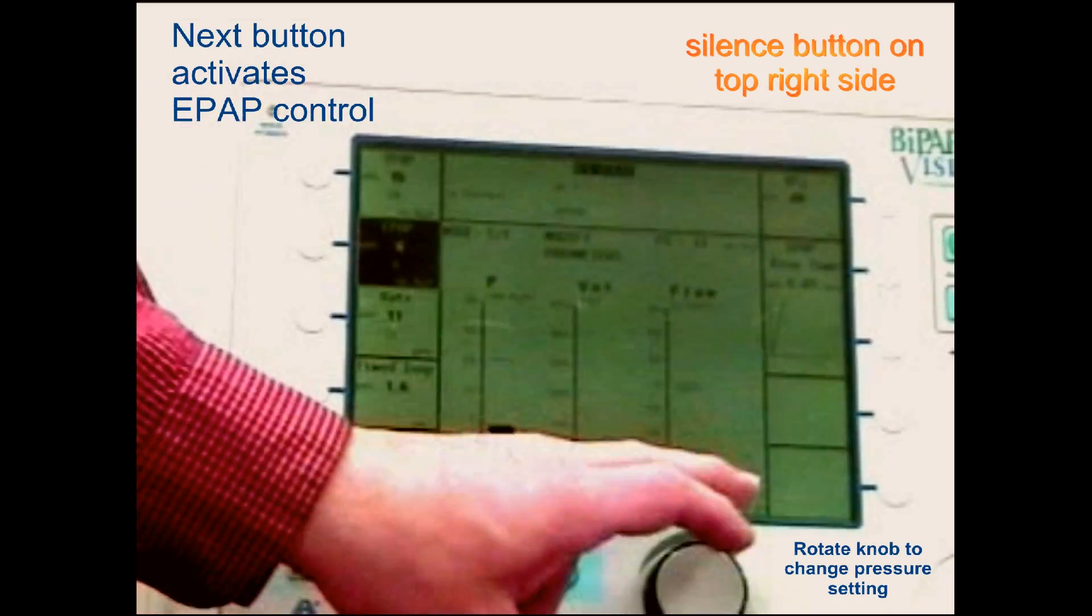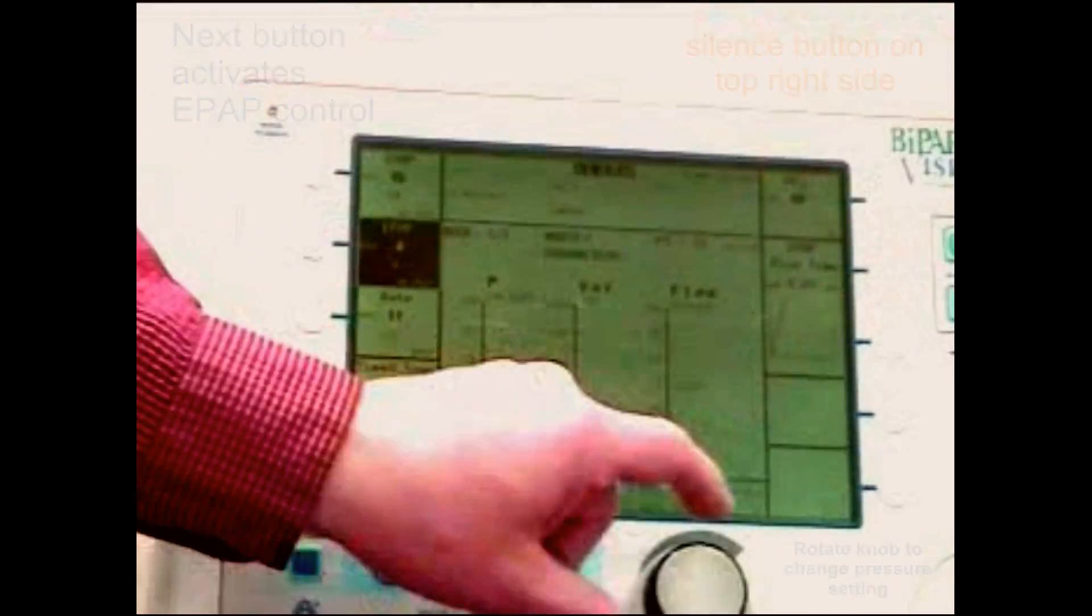Press EPAP. Set your EPAP pressure. We'll use 5.